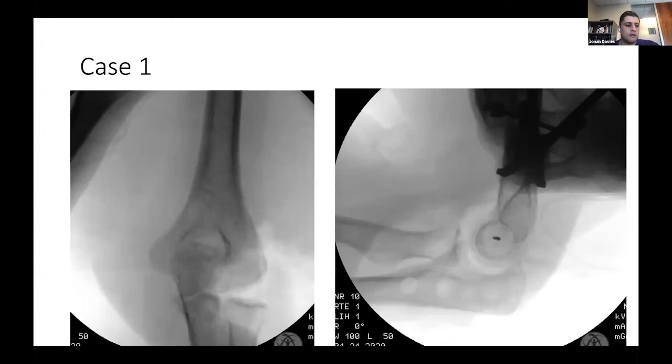And so again, like Terry talked about, this is 4+ weeks out. I'm going to do a reconstruction. I plan to do a lateral reconstruction. And because there's a little bit of subluxation and opening on the medial side as well, I plan to do a medial reconstruction too. And I usually do that with a docking technique, go into the ulna, I make bone tunnels, I pass a weaved semi-T or a gracilis.